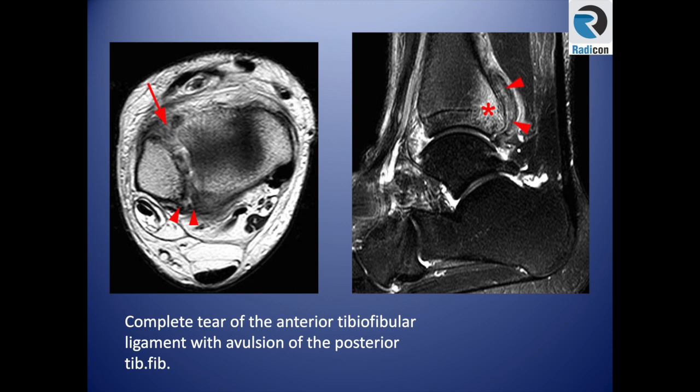Another case shows complete disruption of the anterior and posterior tibiofibular ligaments with thickening and periosteal sleeve elevation of the posterior tibiofibular ligament. If you see a posterior malleolar fracture, it is usually an avulsion fracture of the posterior tibiofibular ligament.